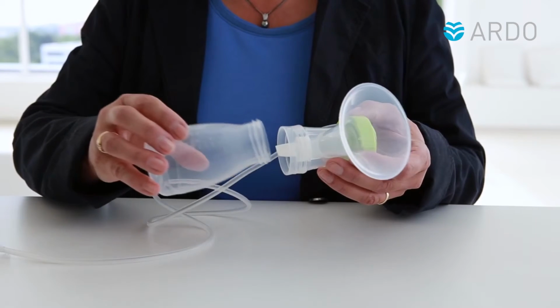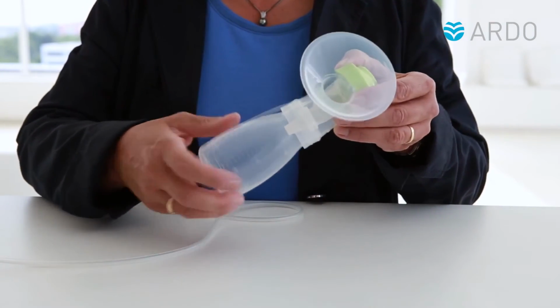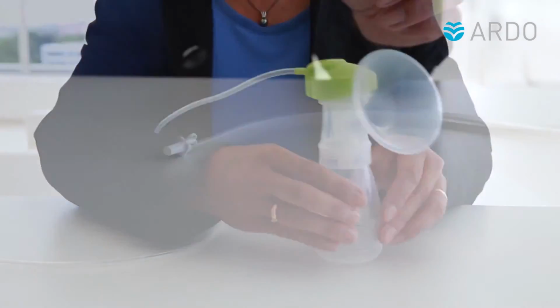Now screw the bottle to the breast shell. The pump set can now be connected to the Ardo breast pump.